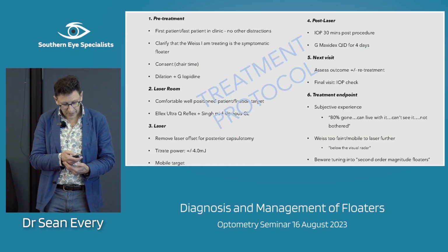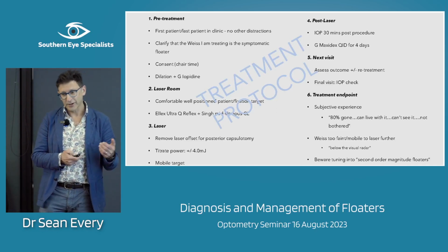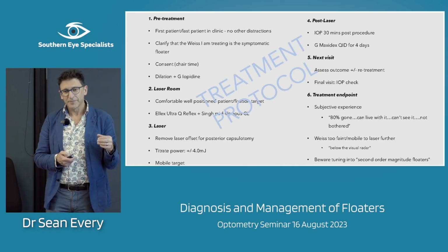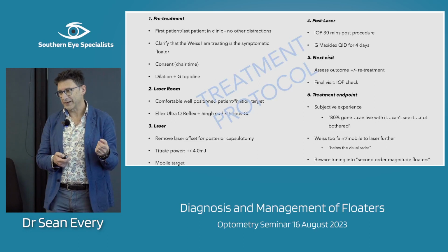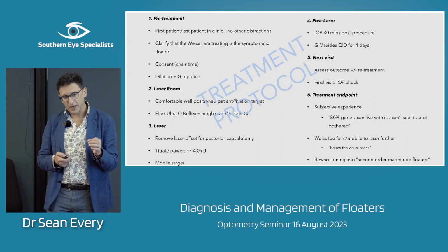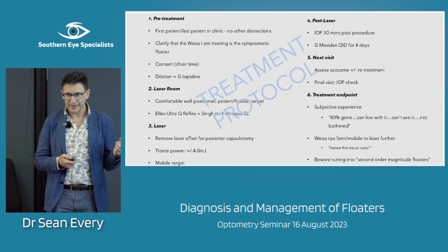Things have improved since then. In terms of the treatment protocol, I don't like other distractions while I'm doing this. The thing that's different about this sort of laser is you're lasering a moving target. Yes, you've got a contact lens on the eye, but it's still moving around a little bit. Everything else I laser is in the same place.